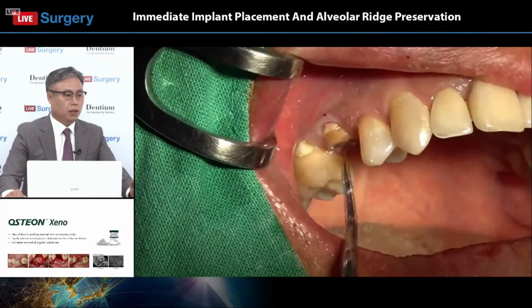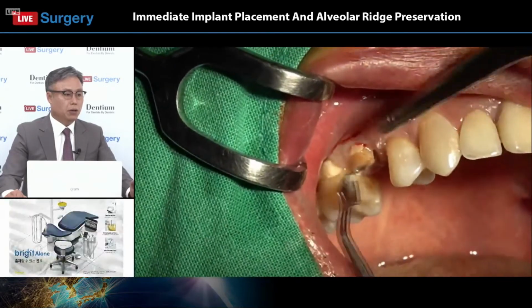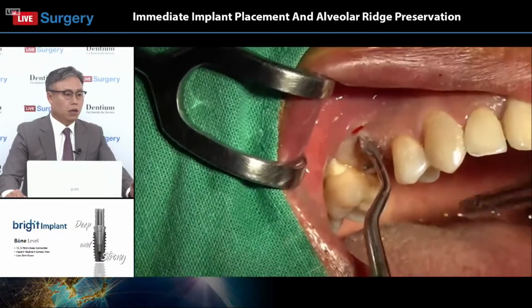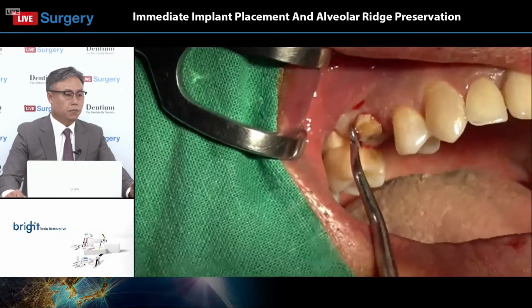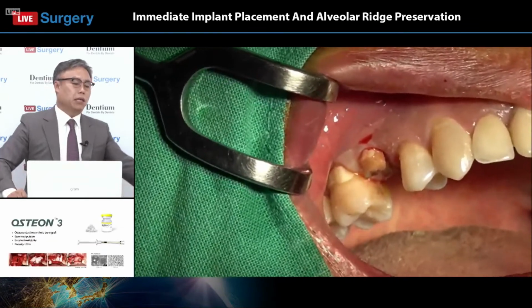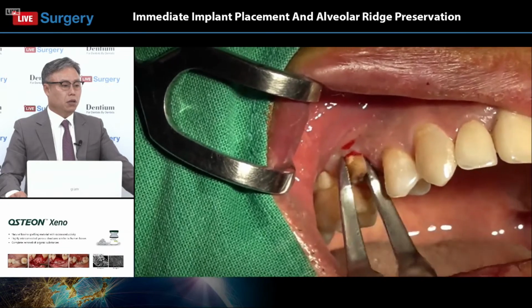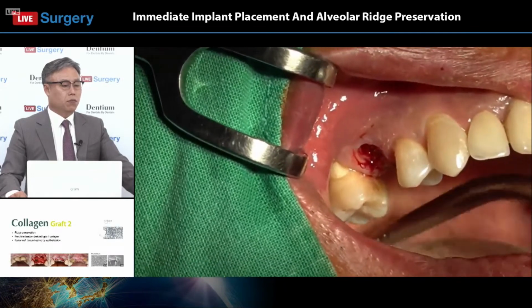And applying some kind of removal of the periodontal ligament, it will make it easier. He is applying the elevator. I think that's a specially designed device, an instrument. I'm not sure what it is, but I think it's very good for luxation. I have to ask him someday. I think the tooth could be easily removed.